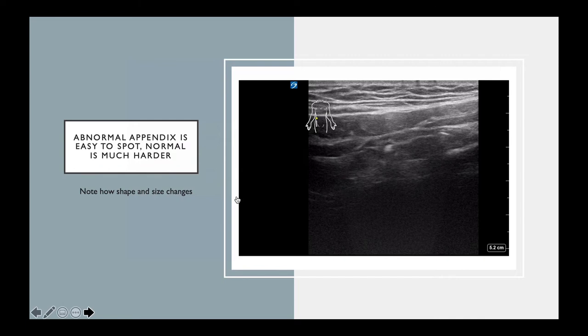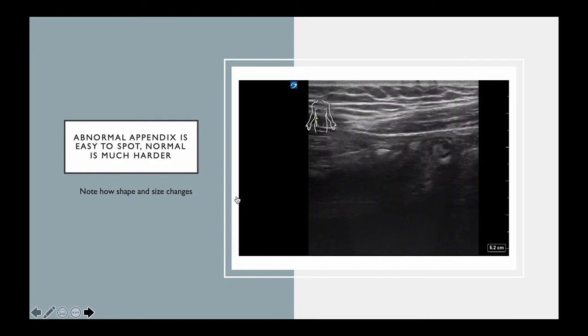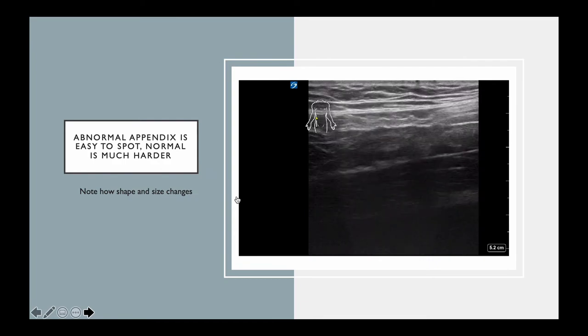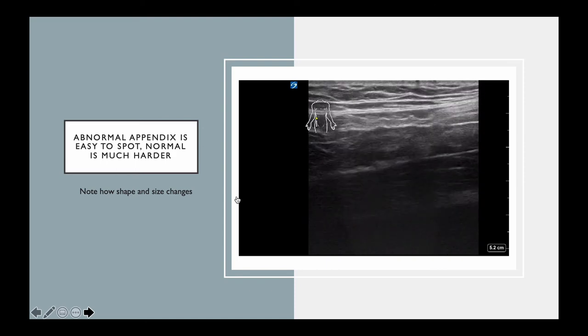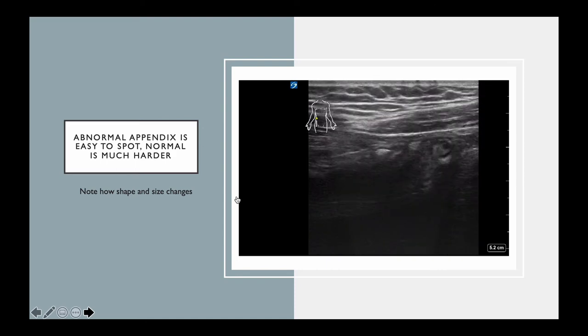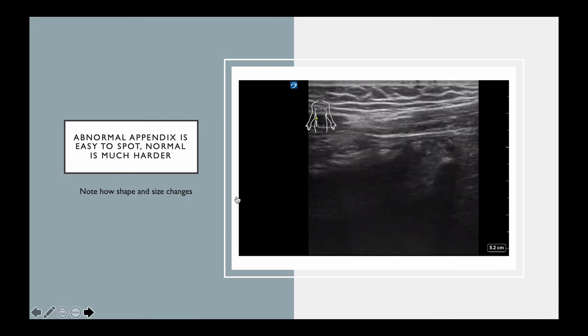Now, an abnormal appendix can be quite easy to spot, but really, we do want you to start looking for a normal appendix. And we're looking for the white dot with a dark halo. Watch it in here. It actually changes size and shape because, as I said, the appendix, when it's normal, isn't a straight line. What's more, it's compressible. There's a little faecalith in it halfway through, I think.